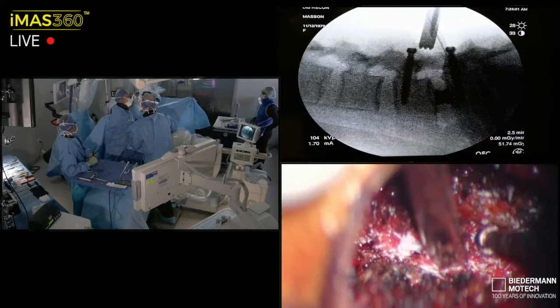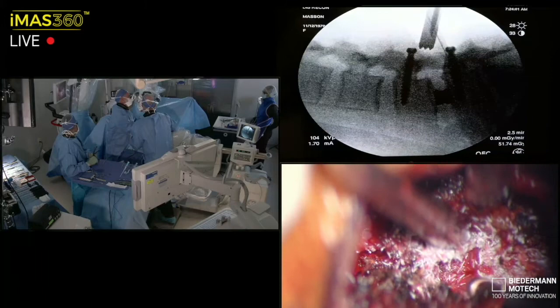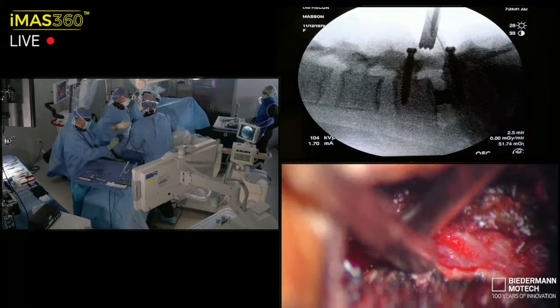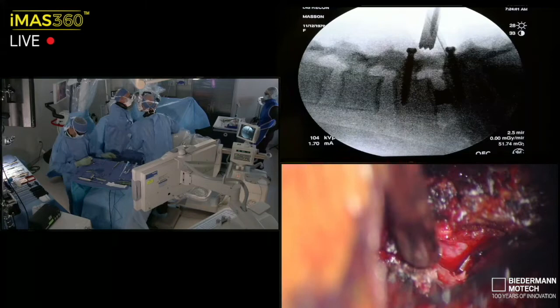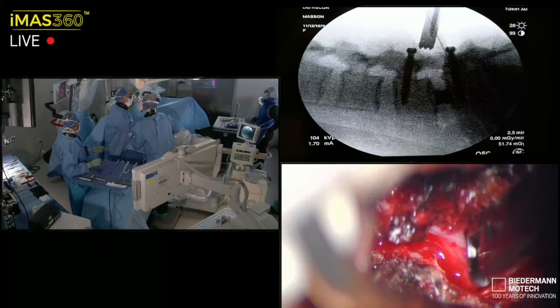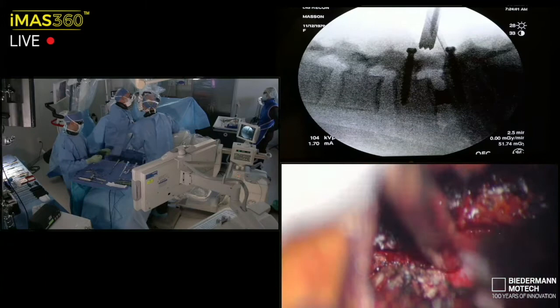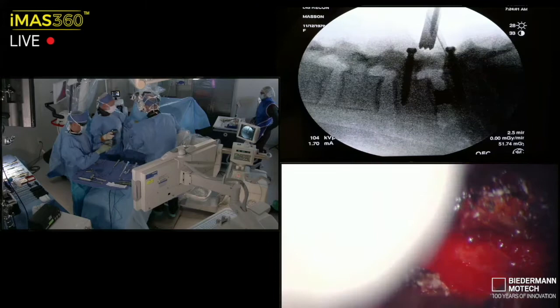My goal is to get this woman straight again, have her walk straight, have her heal, and get back to her very active, enjoyable lifestyle. So details count. All right. There's the proximal L5 foramen. It's rounded out to the pedicle right there. And the majority of her radicular symptoms are L5, so naturally, we want to make sure this is as good as it can be. We've already done the majority of the lateral recess at the 4-5 space, minus that scar, which I haven't decided how aggressive I'll be on yet.